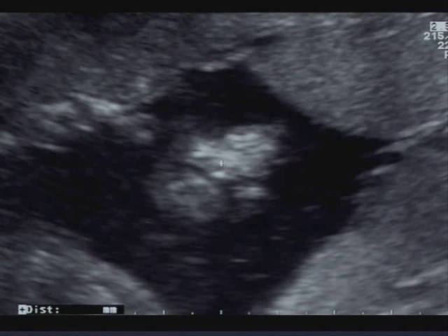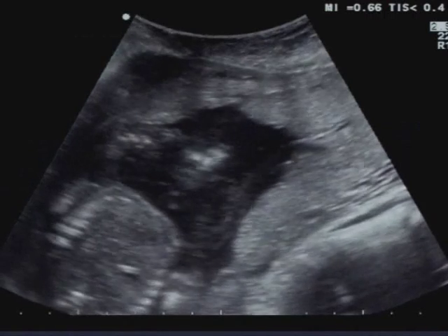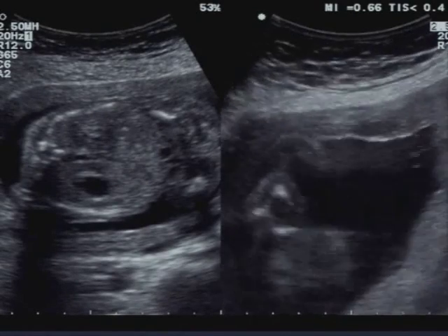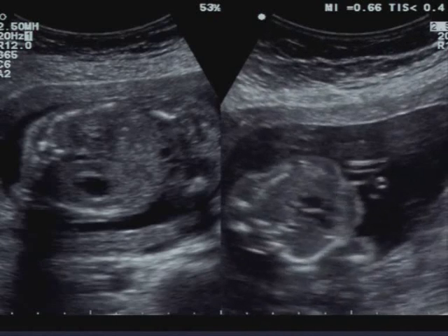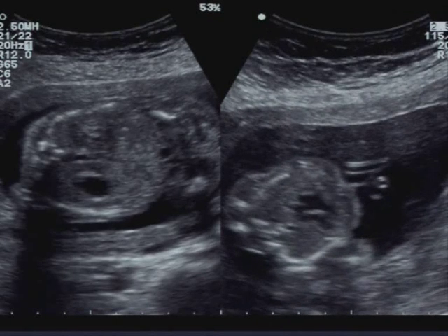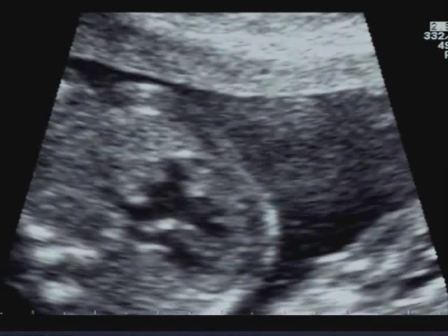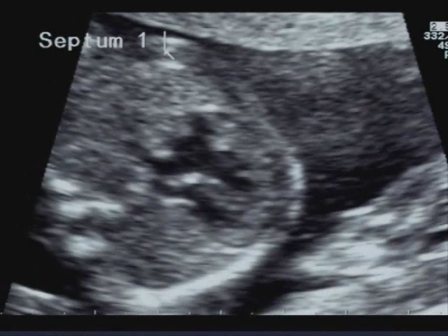In these images, look at the side of the cleft upper lip, which measures 3.4 millimeters in width and 6 millimeters in length. We begin the study of the heart. The first point that we highlight is the situs, which is solitus.